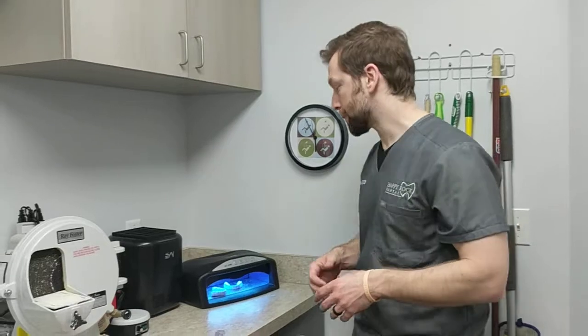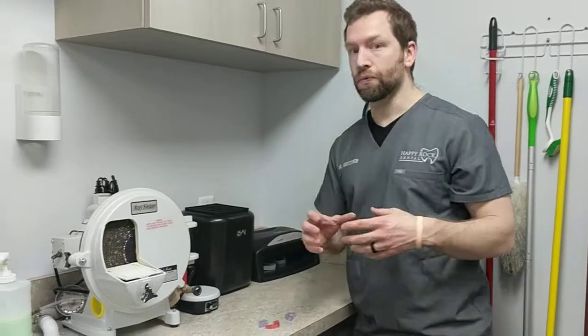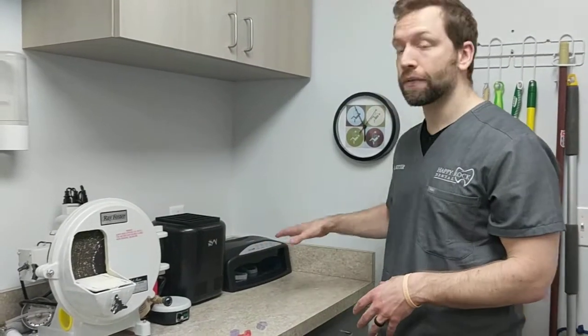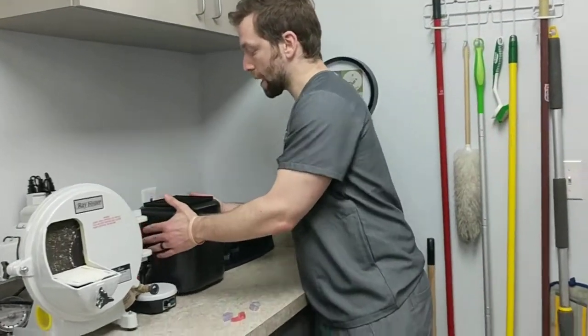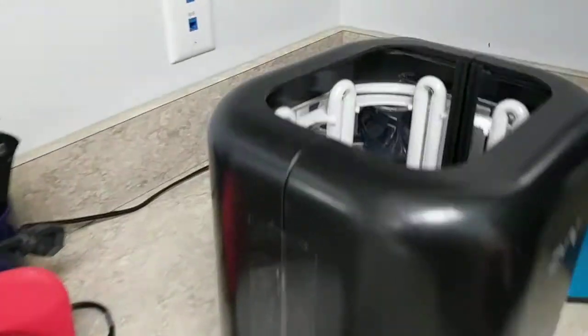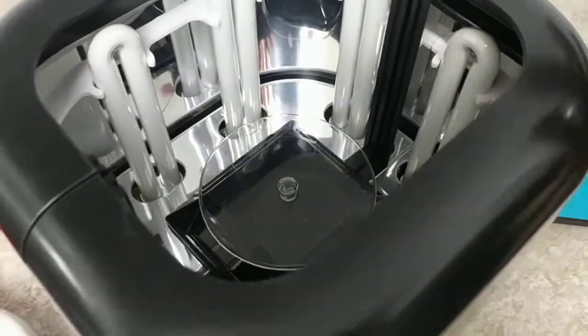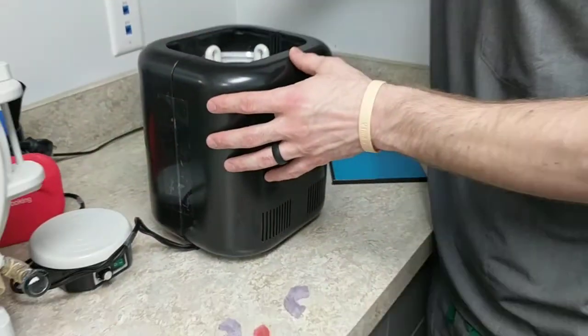It's not in a patient's mouth so it's not as critical, but I still do it. That station is for models and larger objects — volume printing — because I can fit eight models in there fairly easily, even more depending on how cozy things get. But this second station is where I cure my surgical guides and occlusal guards.